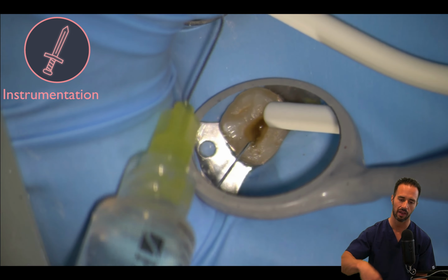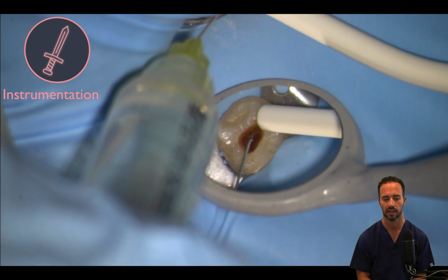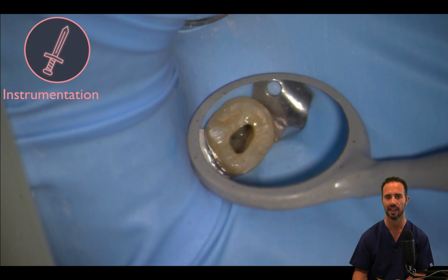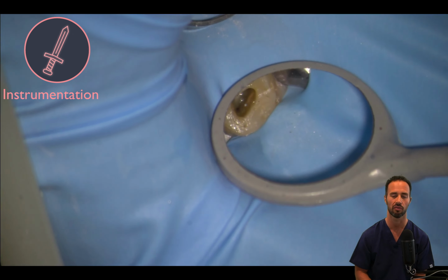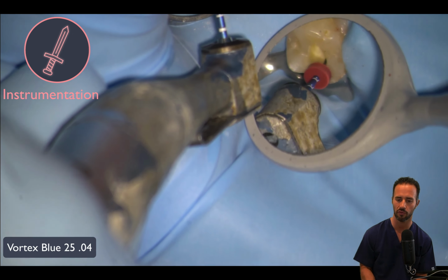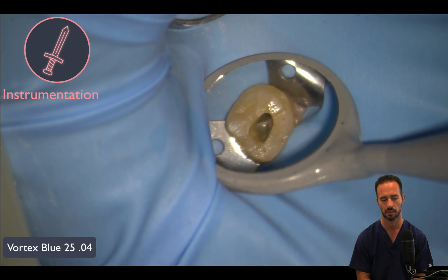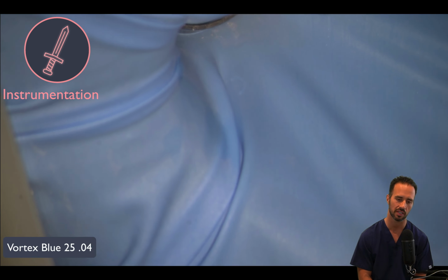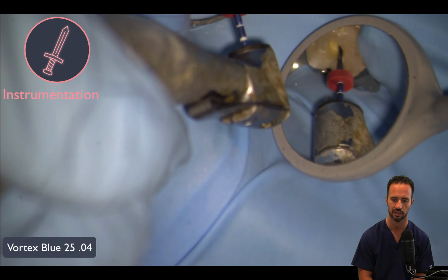Sodium hypochlorite throughout the case. Remember, volume is key, especially with these diluted disinfecting solutions. You want to pass at least 10, more likely and preferably 20 milliliters through the case. So here we go. We've got our 25/04 Vortex Blue all the way down to 18 millimeters, and then we're going to go to the distal buccal at 19, and then finally the palatal at 19.